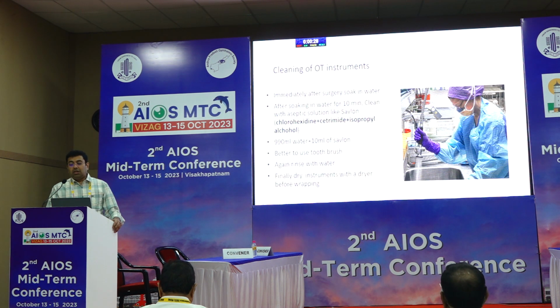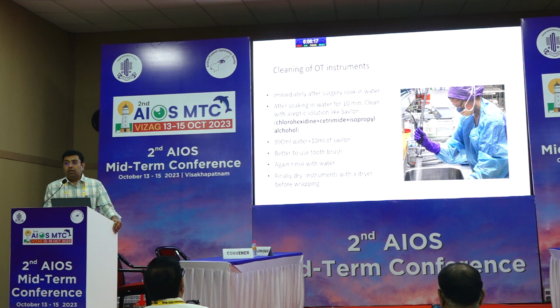So once you complete your operation theater, there is one more thing: you have to see that you are cleaning all the OT instruments. Immediately after the OT, soak all these instruments in water and clean all the instruments with Savlon.